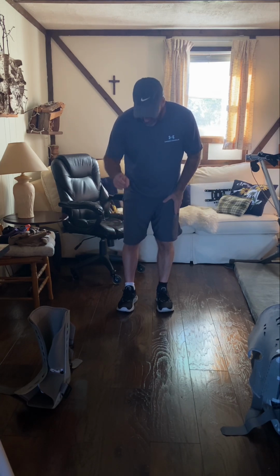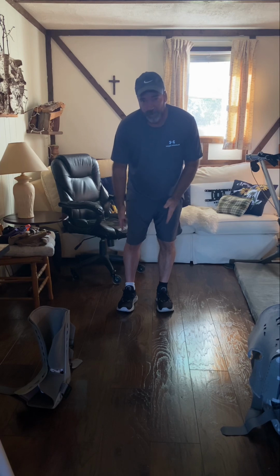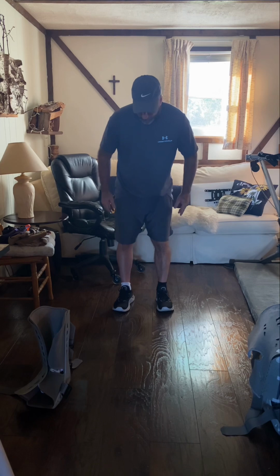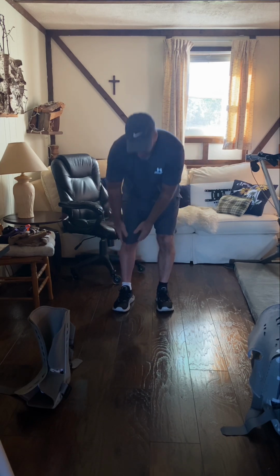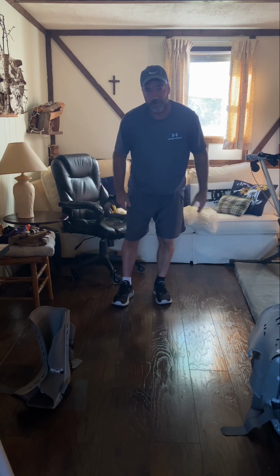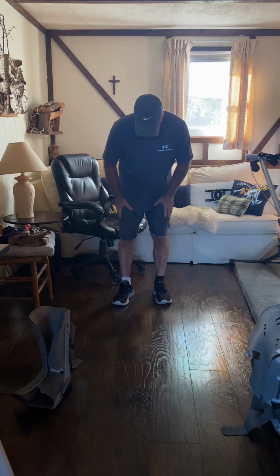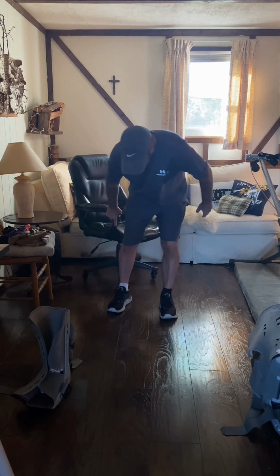Because at first you're going to have kind of nerve pain, heel pain, a lot of different sensations. Your body's just not used to having weight on here. And all of these little tendons and muscles and calf muscles start engaging for the first time in 6, 8, 9 weeks or whatever. They are just not used to it, folks, so they'll get sore pretty quickly.